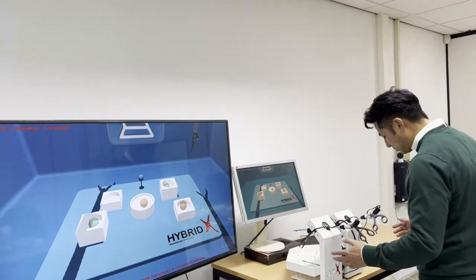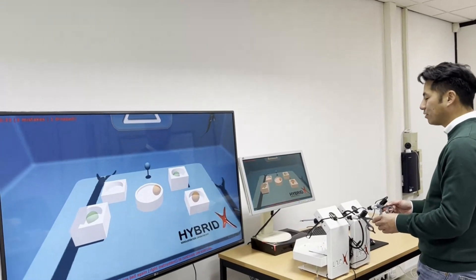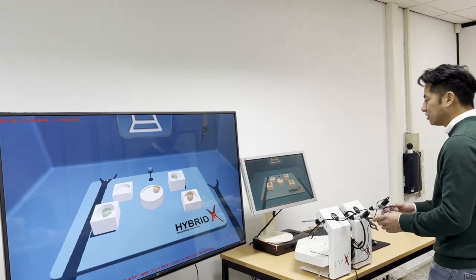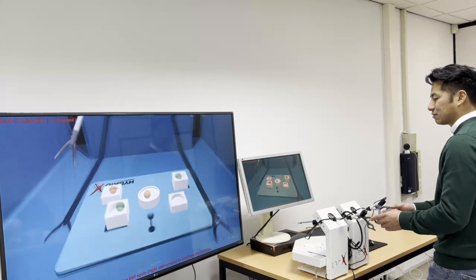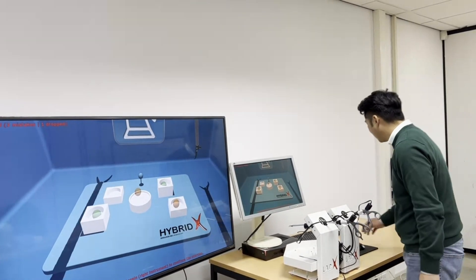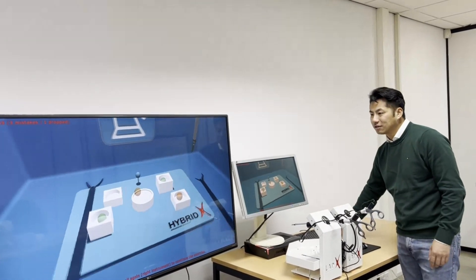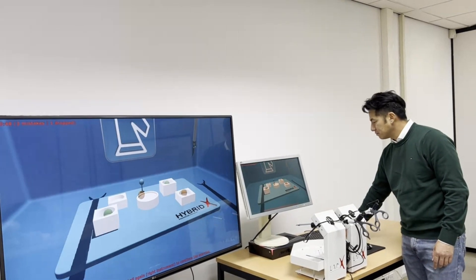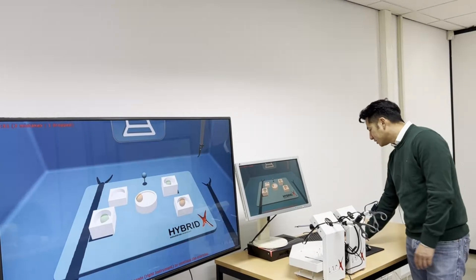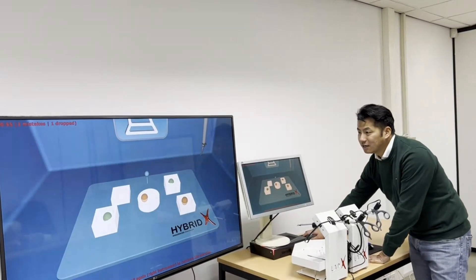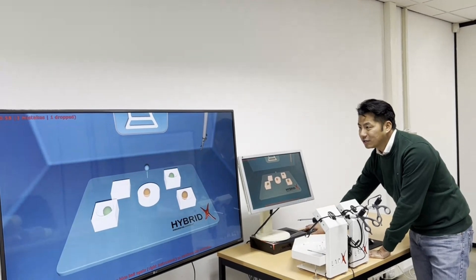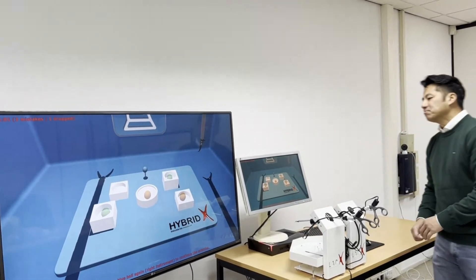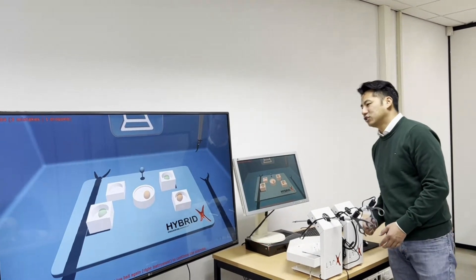The foot pedals in this particular exercise also have some functions. So for example I can zoom in, I can zoom out and I can rotate. I can do this with the arrow keys of the keyboard as well and what is really cool is I can also change the lighting. So I can make no shadow, a little bit of background shadow or make the shadow come back. Because in laparoscopy normally you don't really have a shadow.